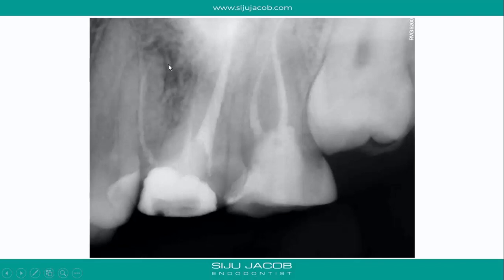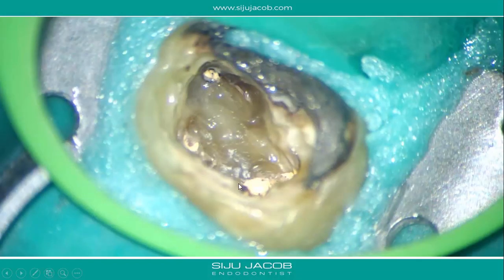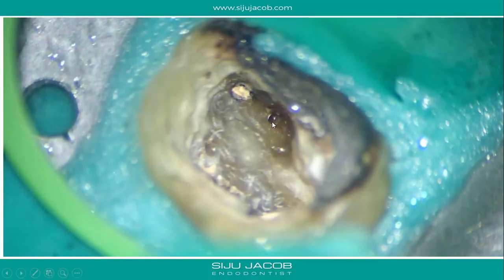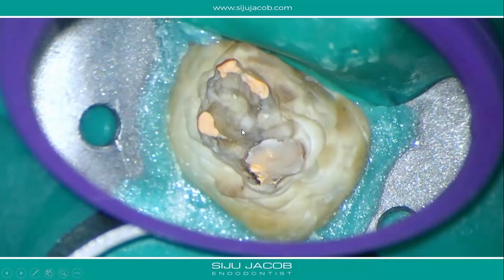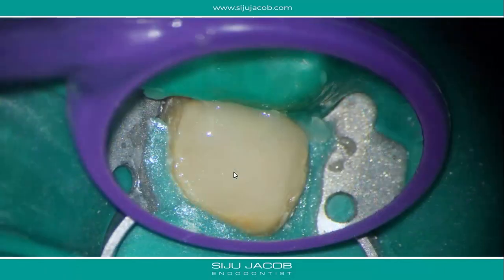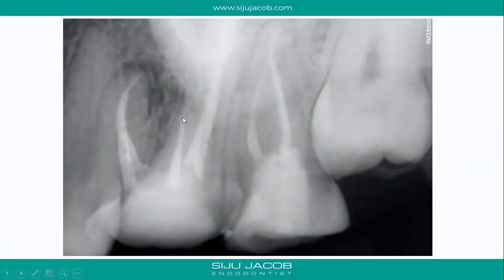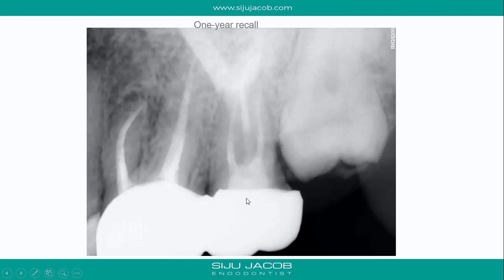We then moved on to the adjacent tooth. The main problem there was the mesiobuccal root — the distobuccal and palatal seemed okay. We removed the glass ionomer filling, cleaned up the area, and immediately identified the mesiobuccal, distobuccal, and palatal along with a characteristic white line leading into the untouched mesiobuccal canal from the previous treatment. We cleaned the mesiobuccal MB1 and MB2 and distobuccal, filled just those, and left the palatal alone as there was no need to touch it. On the one-year recall the case appears to be healing and doing very well.